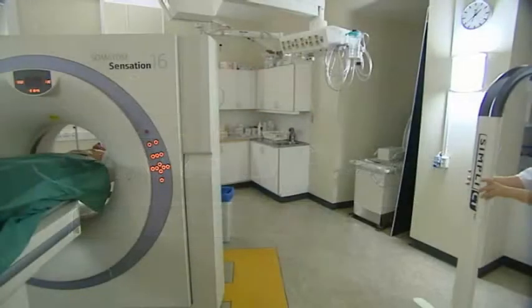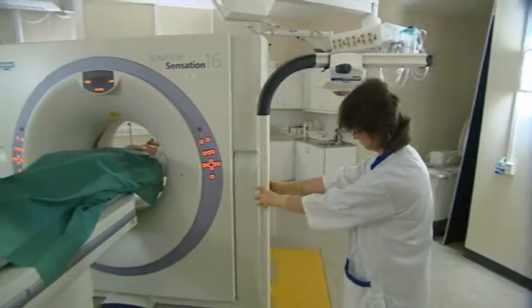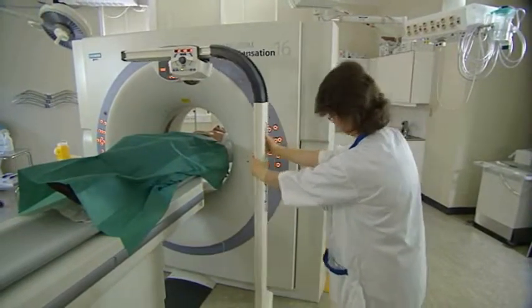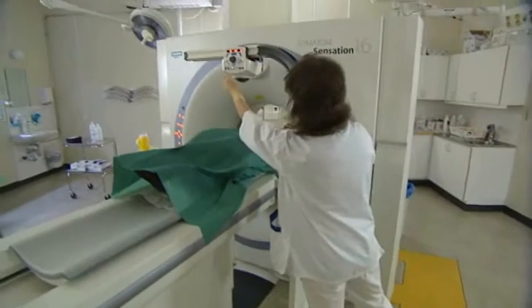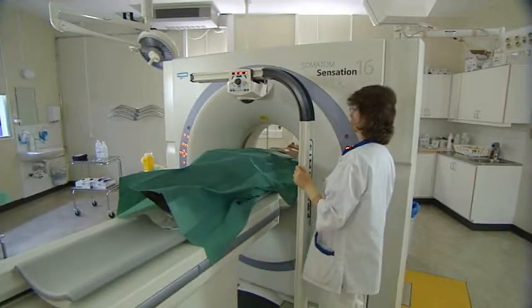An easy and convenient setup is the key to the usability of the SimpliCT. Roll the unit close to the CT table and swing the horizontal arm over the table by pressing the turning knob on the base. Remember to close down the brake prior to aligning the system, thus avoiding pushing the unit out of alignment, as can be the case if done reversely.